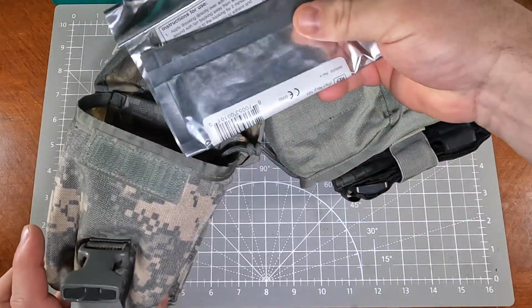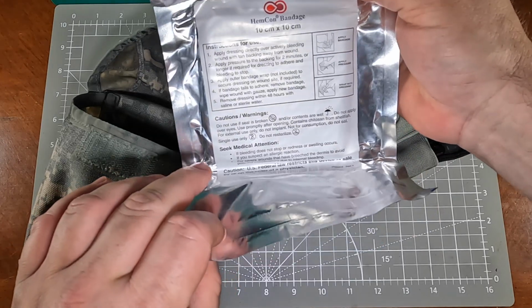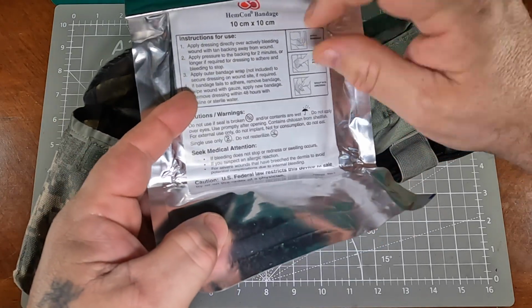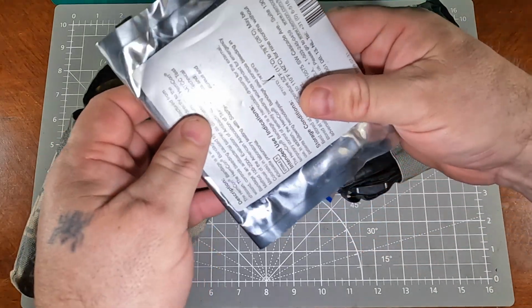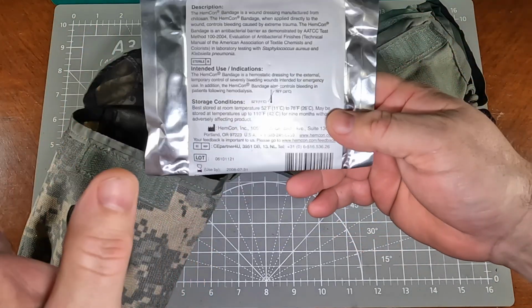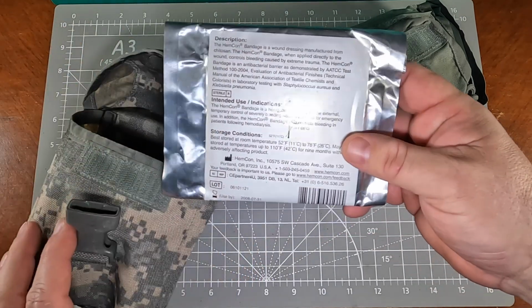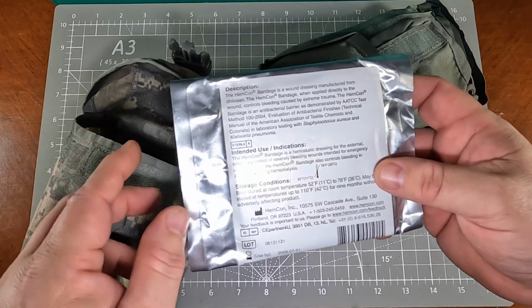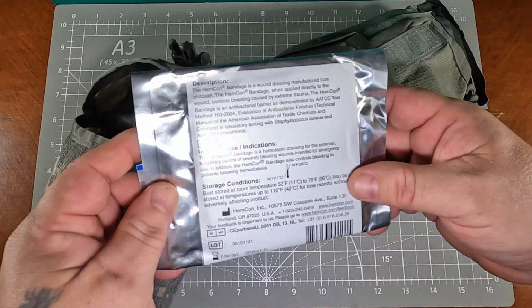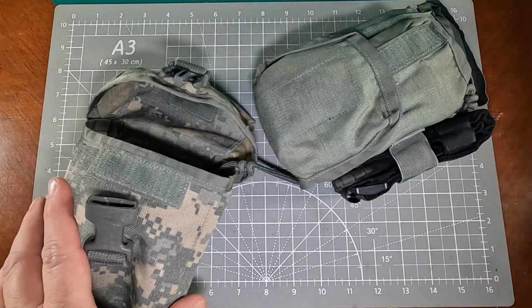In the back of here for Iraq, we added chitosan dressing. Basically, if you have somebody that has heavy bleeding or something like that, HemCon has chitosan, or like a shrimp product type thing, I guess, that helps stop bleeding and clotting. For a while, these are the way to go. Then they went to some QuikClot stuff that burned people, and they moved on to some newer stuff that's a little bit cooler and doesn't have as much of an effect. But this is what I had in Iraq.